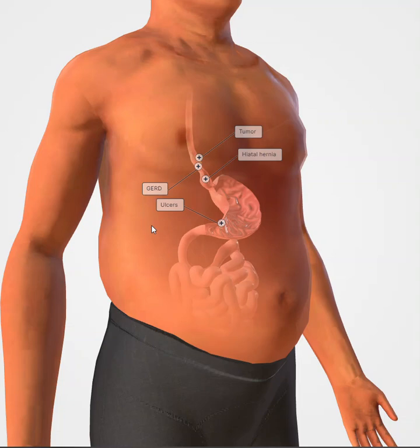So this is also showing you that an LPO position of the patient, when we take the X-ray, will show anatomical structures turned in the same way and look very similar on an RAO positioned X-ray.